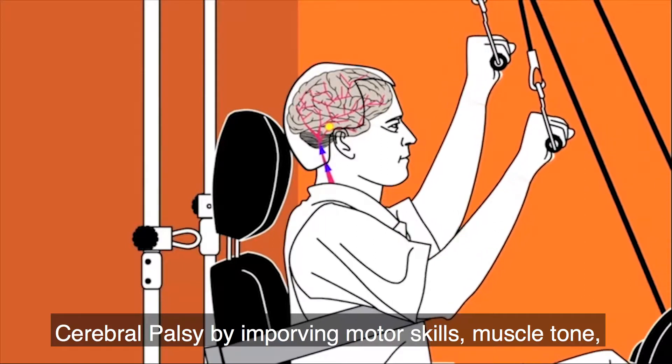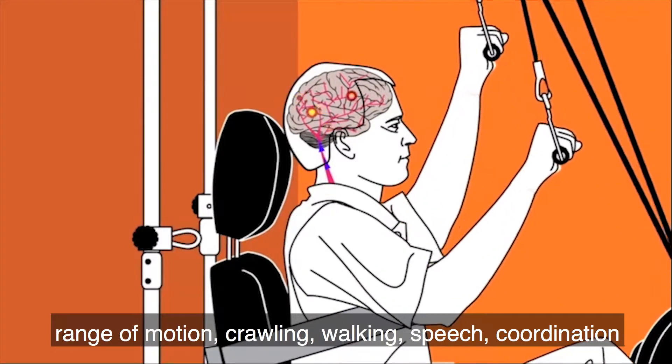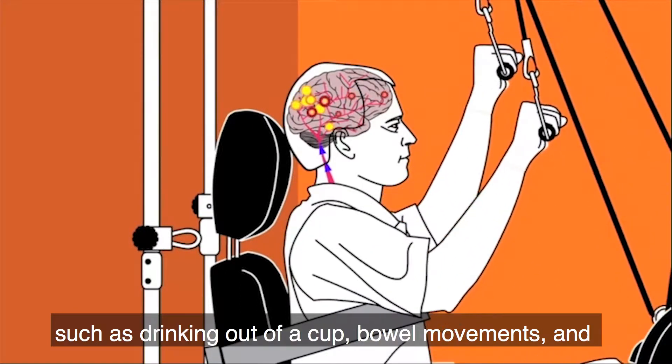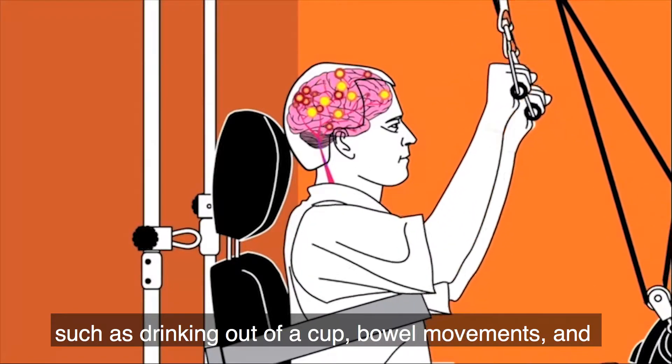This can help cerebral palsy by improving motor skills, muscle tone, range of motion, crawling, walking, speech, coordination such as drinking out of a cup, bowel movements, and bladder function.